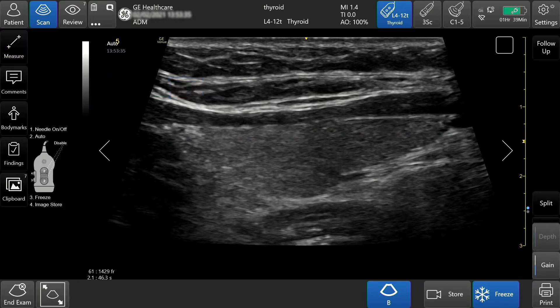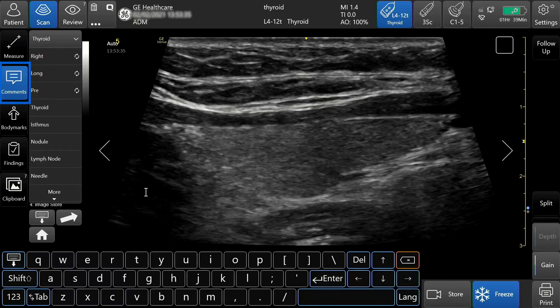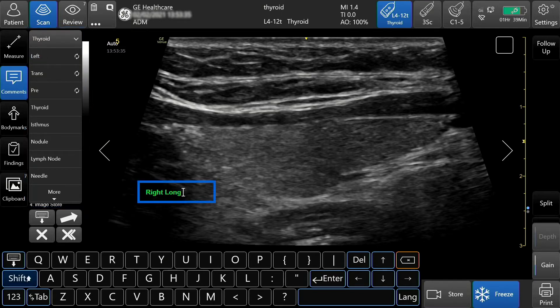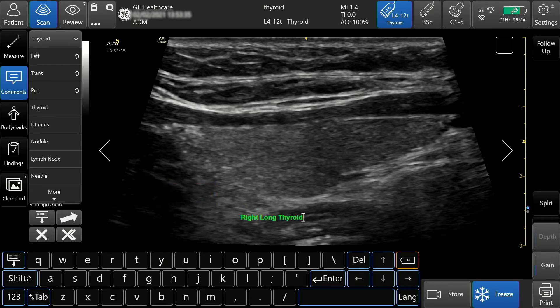To add an annotation, select the comments on the touch screen. Choose comments from the annotation library, or you can use the keyboard that populates upon selecting comments. You can tap and drag the annotation to its desired location.